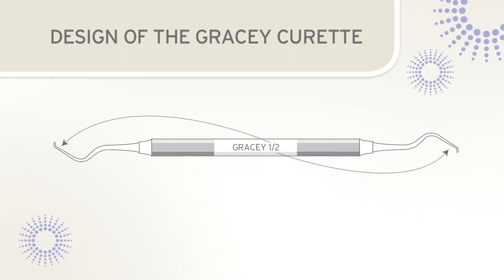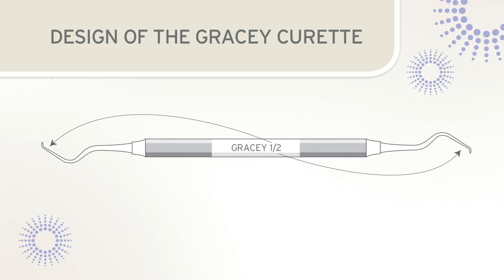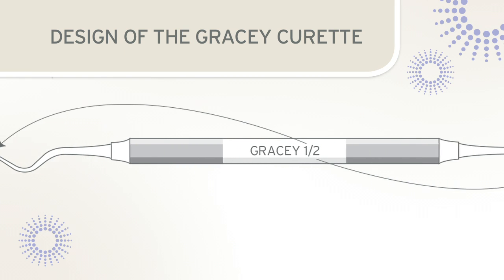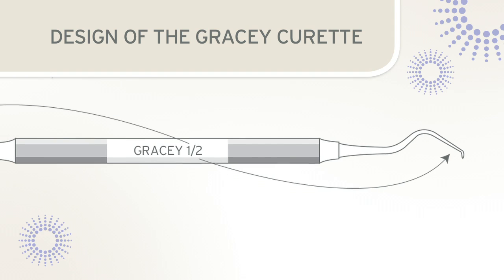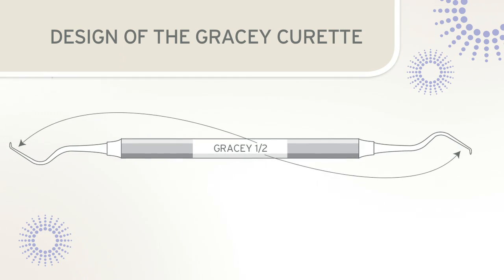Gracie instruments are paired designs with each blade identified by a number. Each double-ended Gracie has an odd and an even numbered blade. For example, a Gracie 1-2 has the number one blade on one end and the number two blade on the other end. This blade number is important as it will help determine positioning of the blade during sharpening.